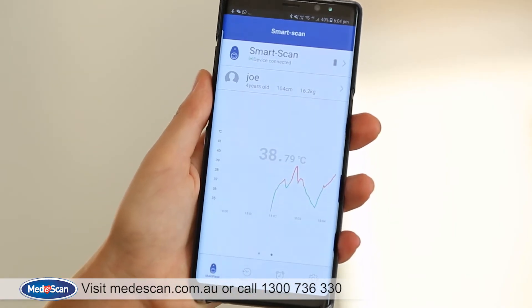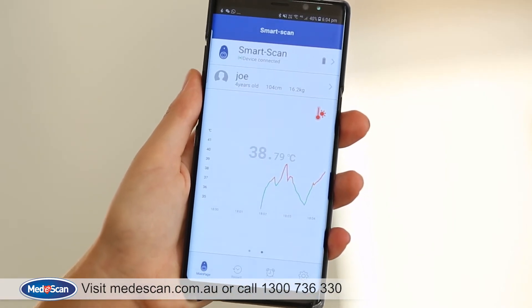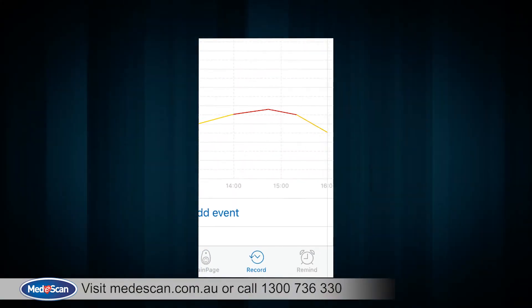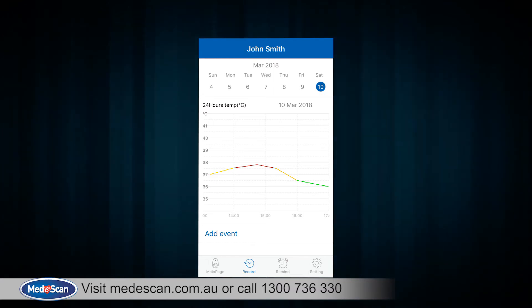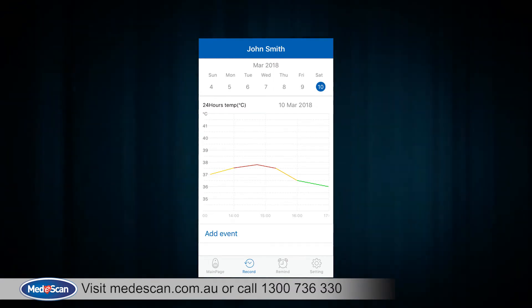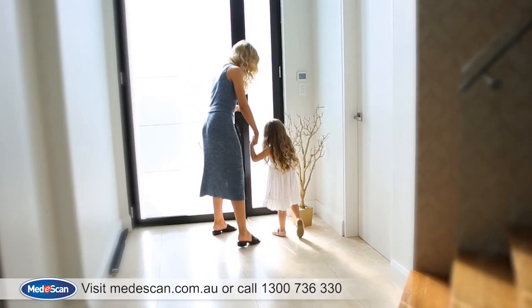Swipe to the right to access a quick summary for temperature readings from the last five minutes. Press on the records tab and the application will provide you with a graph displaying the change in temperature for the last 24 hours. This feature is perfect for when you visit your GP.